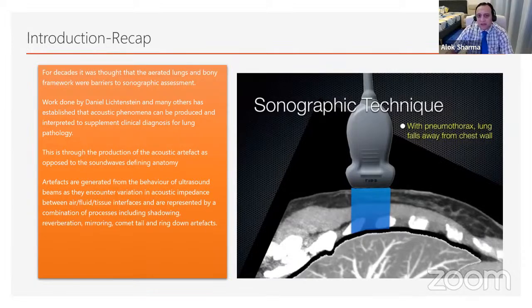As you can see, over just 2 weeks, some of our colleagues who have presented had never done lung ultrasound before, yet the learning curve is very quick. For those of you who attended my first lecture, I said the learning curve for lung ultrasound is very quick compared to cranial ultrasound or echocardiography. Your ability to describe what you can see is absolutely crucial.